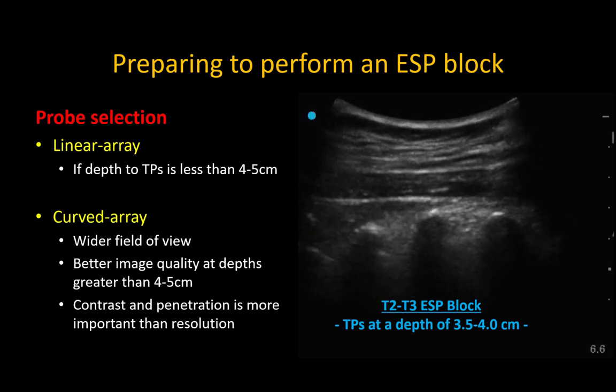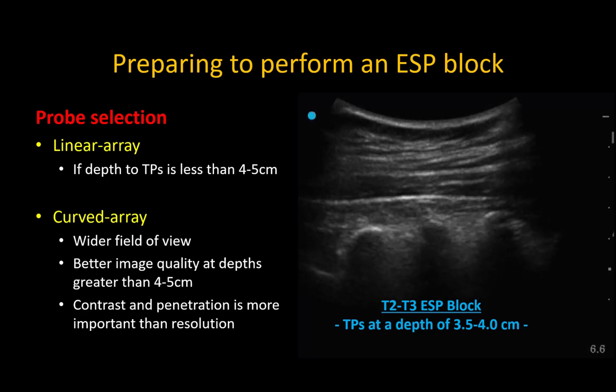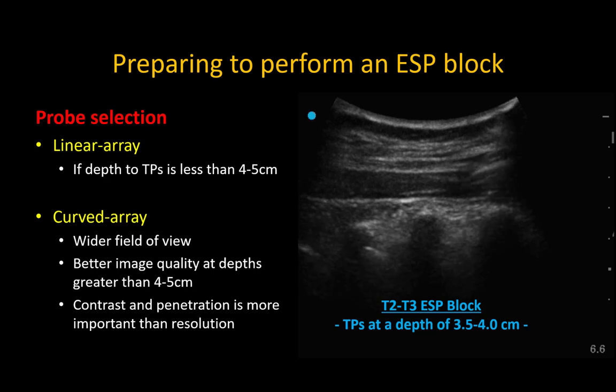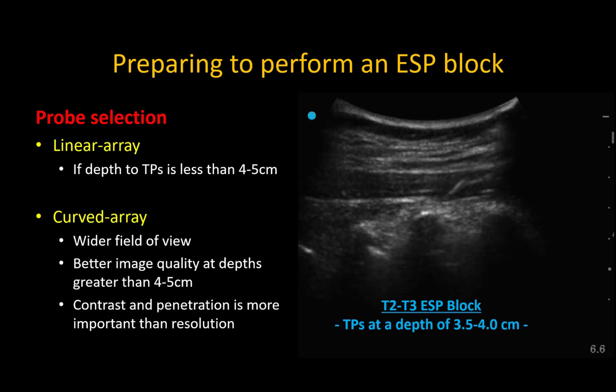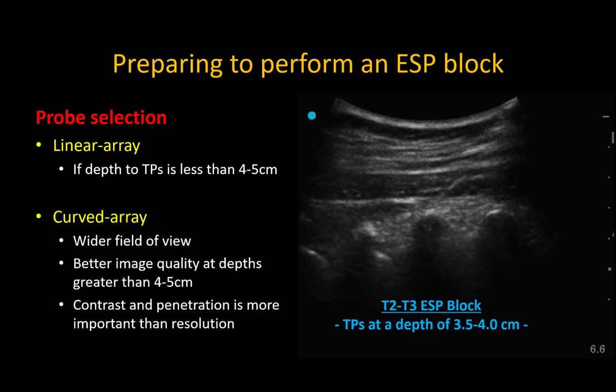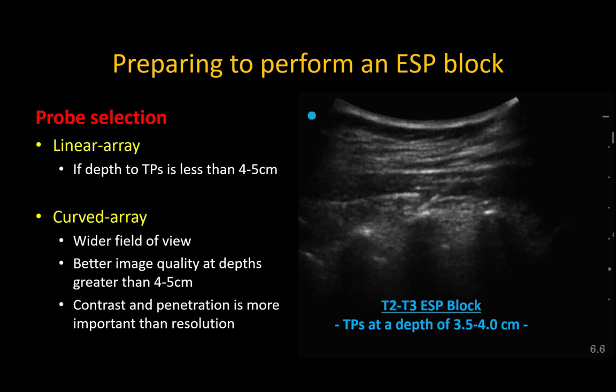The preparation for an ESP block is the same regardless. A linear probe is generally suitable in slim patients in the thoracic region, but in many individuals the high thoracic and low thoracic transverse processes can be quite deep due to the overlying muscle layers. I have a low threshold for using a curved probe, which often provides much better penetration and contrast in terms of lighting up the fascial layers, and I consider this more important than resolution for this particular block technique.